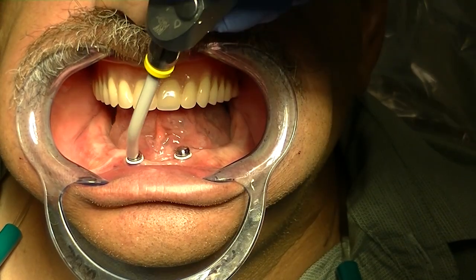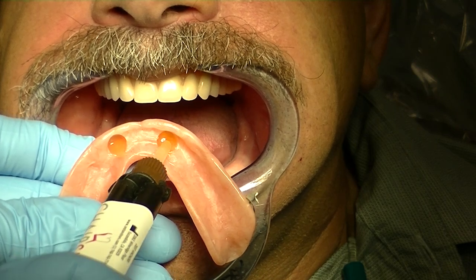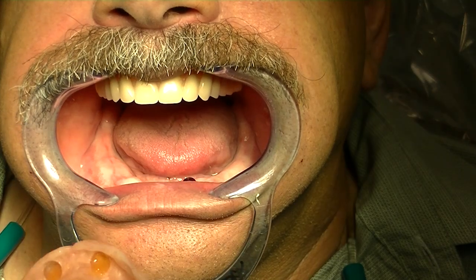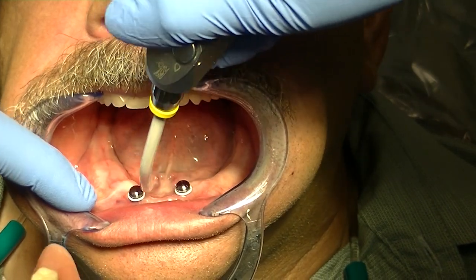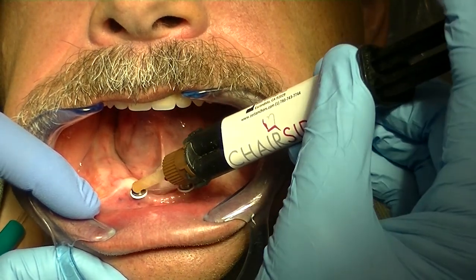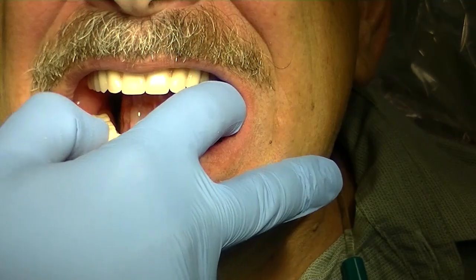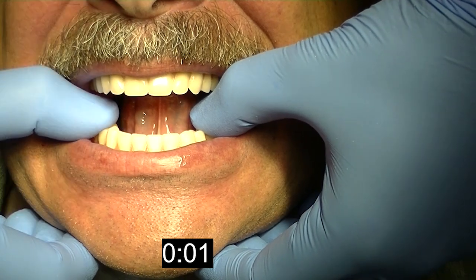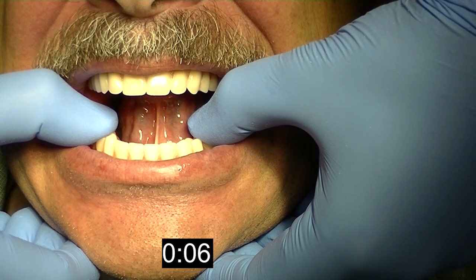We do not need a primer or any sort of conditioning agent for the chair side material. What we're going to do is inject directly into the recesses, filling about two-thirds of the way full, drying off the locator denture cap, as well as putting just a hair of the chair side processing material on top of the locator attachments. Carefully seating the denture in a passive fashion on the edentulous ridge, I'm going to be holding the complete denture with light finger pressure, creating a C-shape around the patient's mandible.